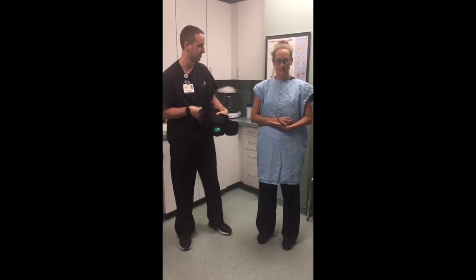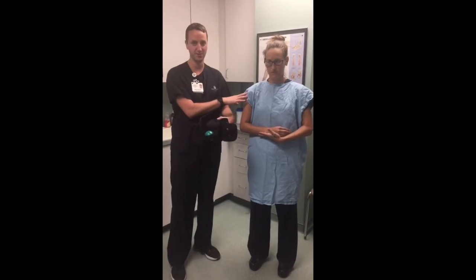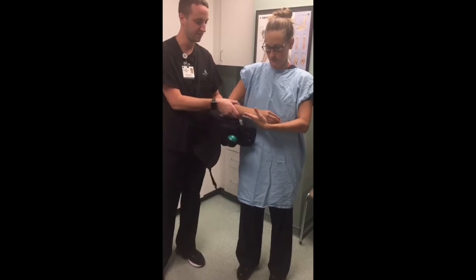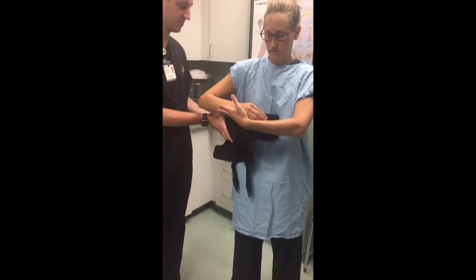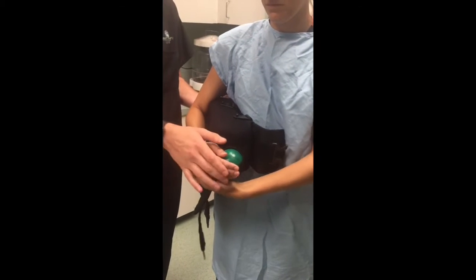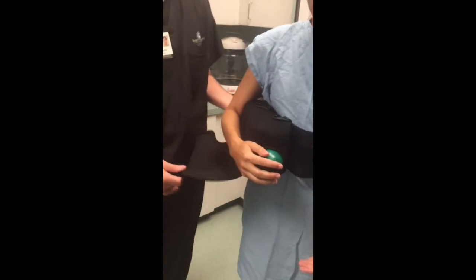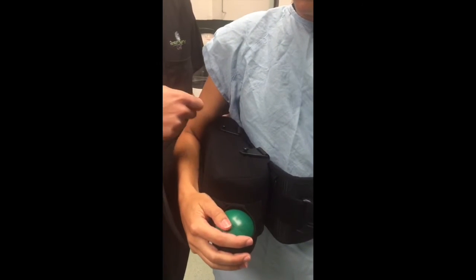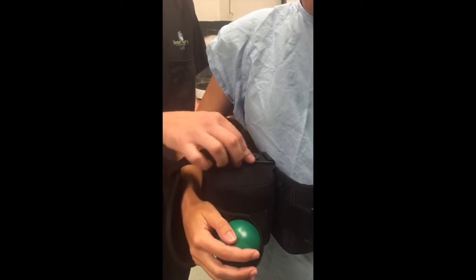The first thing you'll want to do, and in this case the patient has had surgery on their right shoulder, while they're supporting their arm, you want to put the sling underneath their arm, making sure the pillow is in between their arm and their body. And also make sure they're holding onto the ball, and while doing so, you can pull this sleeve up, and as you can see on the top of the sling here, there will be two buttons to click these straps into.